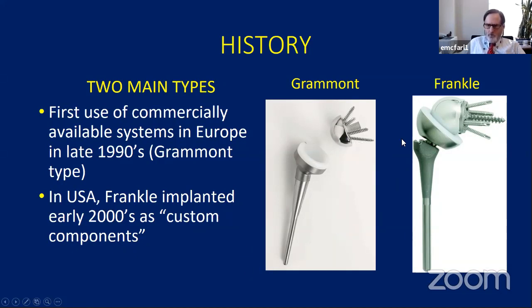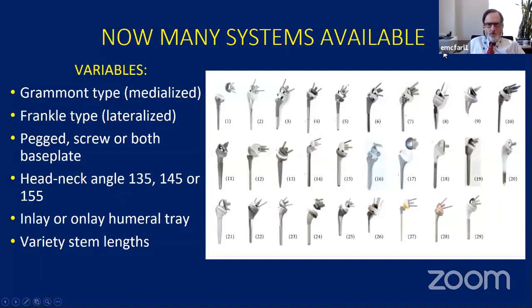These two were competing models through the 2000s and early 2010s, while we figured out which ones had the best results. Since then, though, there are probably 30 or 35 systems, and they all vary according to different configurations of the glenoids or whatever. So when you do start doing these, you have to pay attention to some of the geometries. The good news is most of them work pretty well.